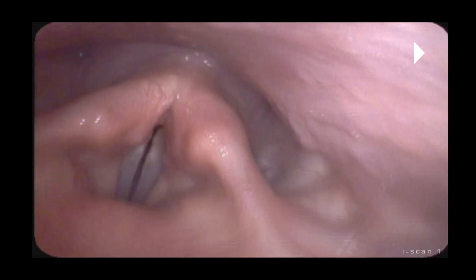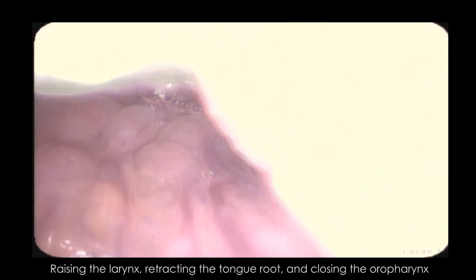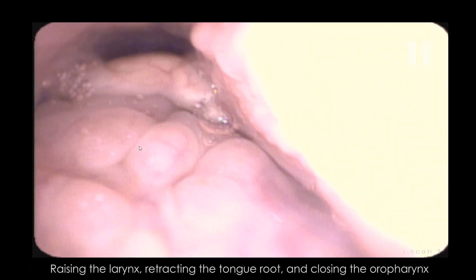He asked me if there's anything I wanted to see, and I was kind of caught off guard because there's a lot of stuff I wanted to do. But since I had a camera in my nose it was kind of hard to think of things on the spot. So I asked him if I could raise my larynx, and he said yes — and I did it really fast. So I do it a little bit slower, and this is so exciting to see.